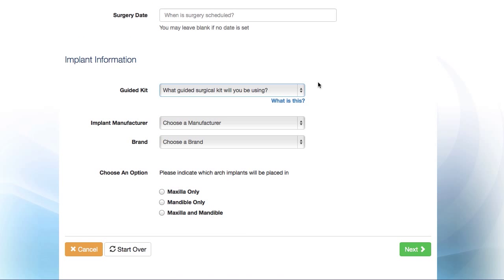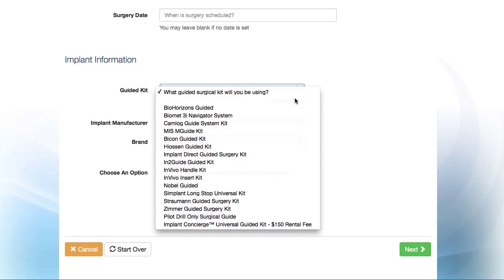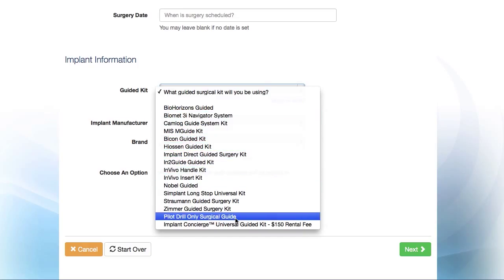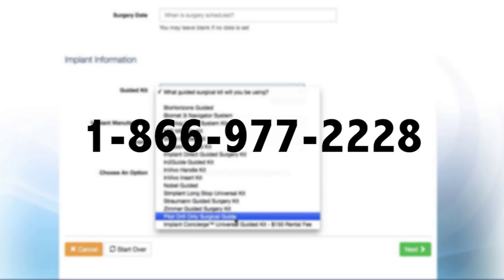Now, let's move to the Implant Information section and select which guided surgical kit you will be using for surgery. Implant Concierge is compatible with most guided implant manufacturers. If your guided kit is not listed, please contact us so we can add it.